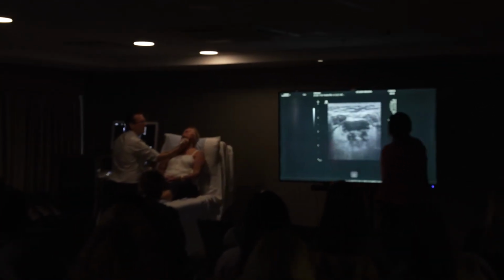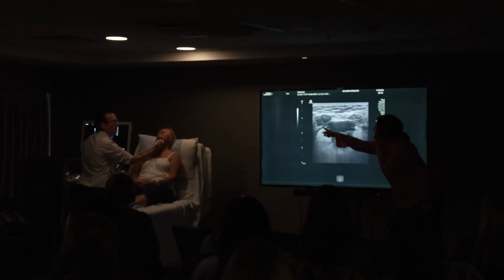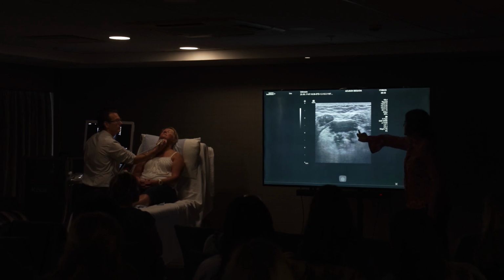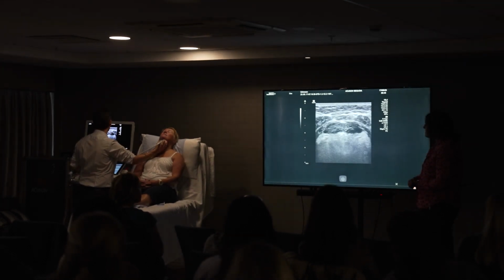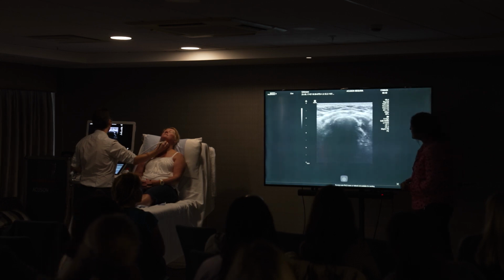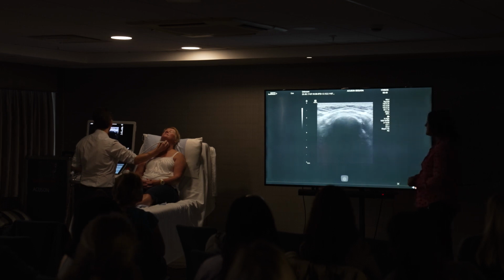As Michael mentioned, we've got the anterior belly of the digastric muscles. You've got that sling, the mylohyoid muscle. You've got the geniohyoid, the genioglossus, and the sublingual glands laterally. Then you just come back towards the hyoid. As you come back, there's the hyoid, that reflective structure. And then you're down into level 6.